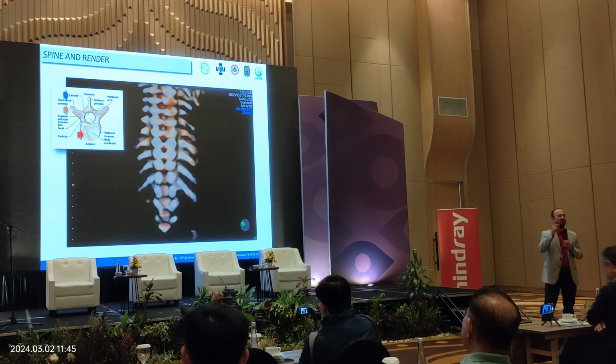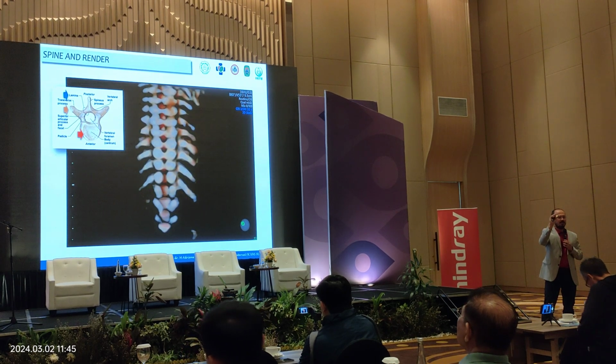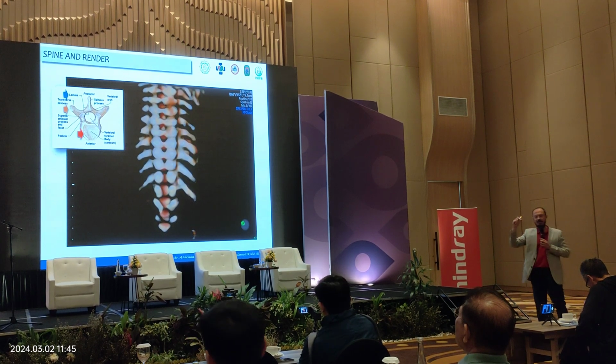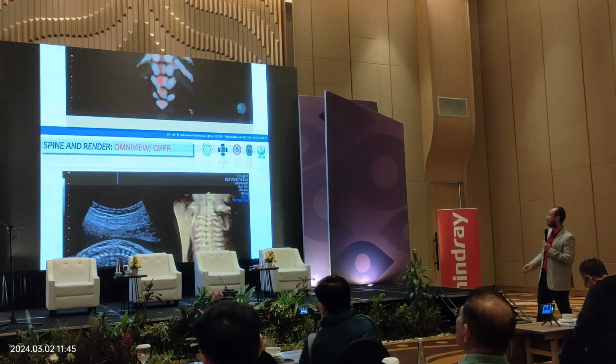And we can see here for the spina bifida, what we are using the 3-dimensional for is to notice 3 important parts of the vertebrae of the spine: the body, the wings, and the connection between the left and the right wings. So 3 parts you must appreciate, you must investigate. This is the wing, this is the connection between wings, and this is the body.